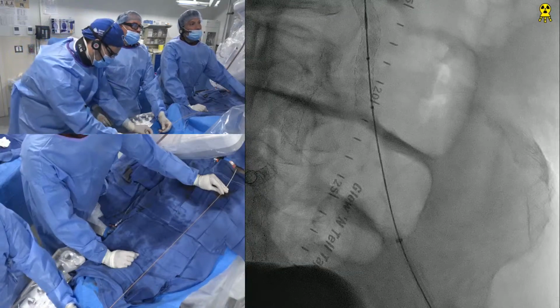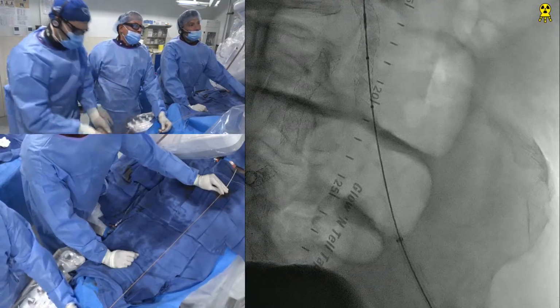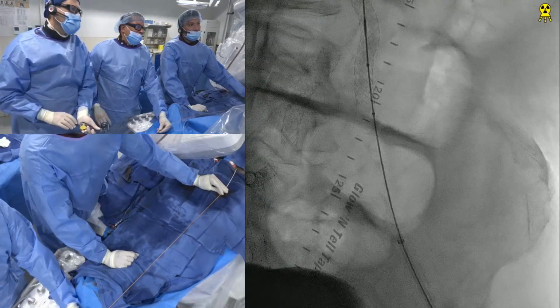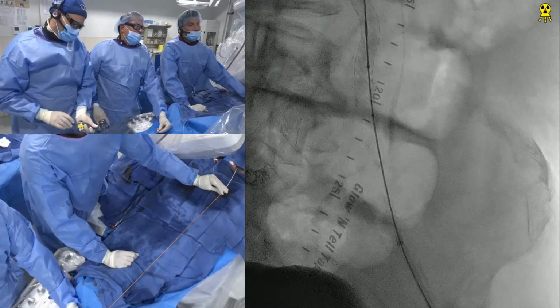What's nominal here, Chief? Go for it. Yeah, well, actually, let's pull down a little bit more. Five. Right there. Go 5. 8. Yeah, go to 5.